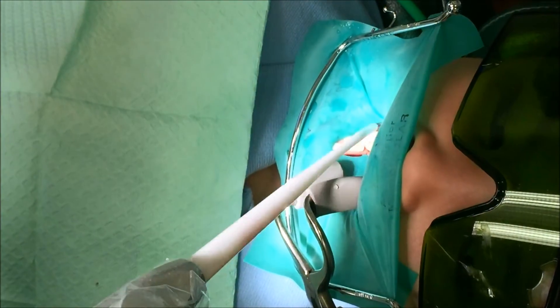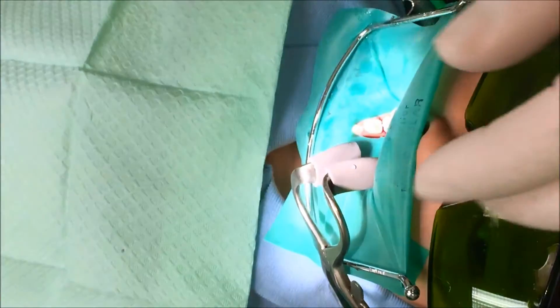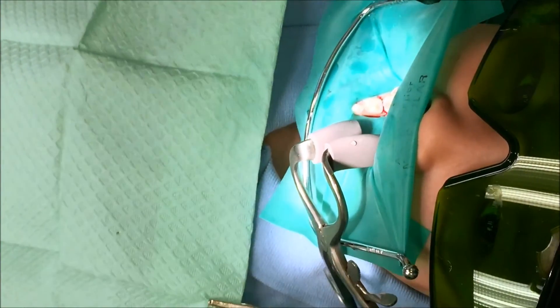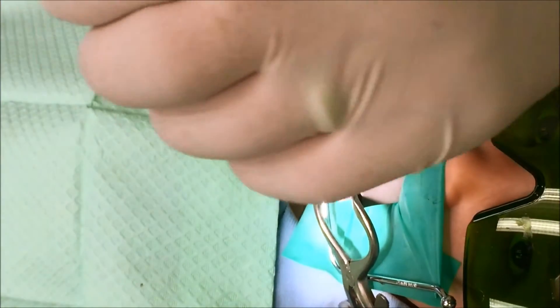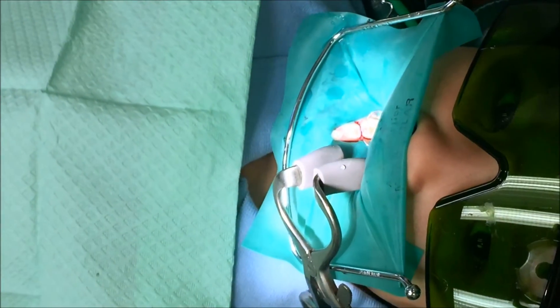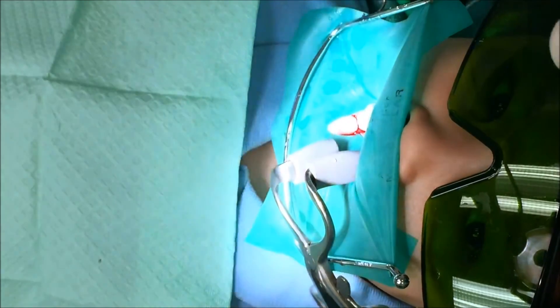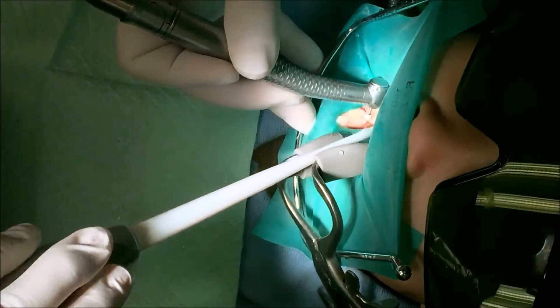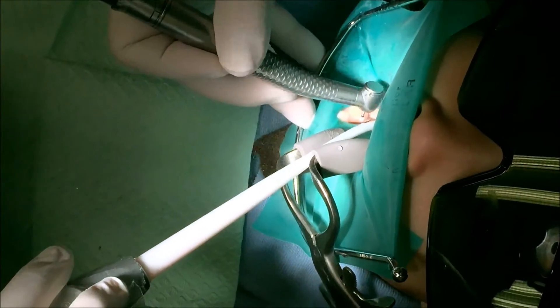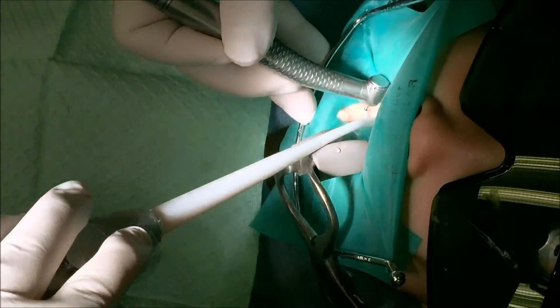Let's polish the filling. Can I have the round bur, please — and then the 12-fluted next. Here we go, just to polish the filling. Make sure there's nothing sharp here. Good job.